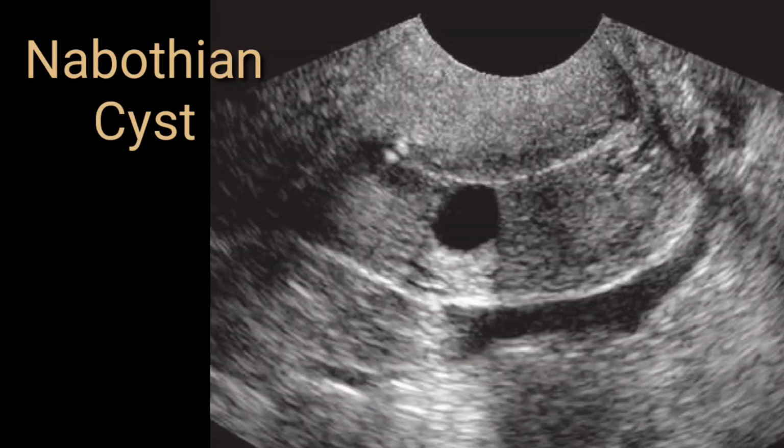This is another transvaginal scan, and on this scan the cervix is clearly visible, cervical canal is visible. On the posterior wall you can appreciate a well-defined simple cystic lesion with acoustic enhancement. So this is actually a cyst.